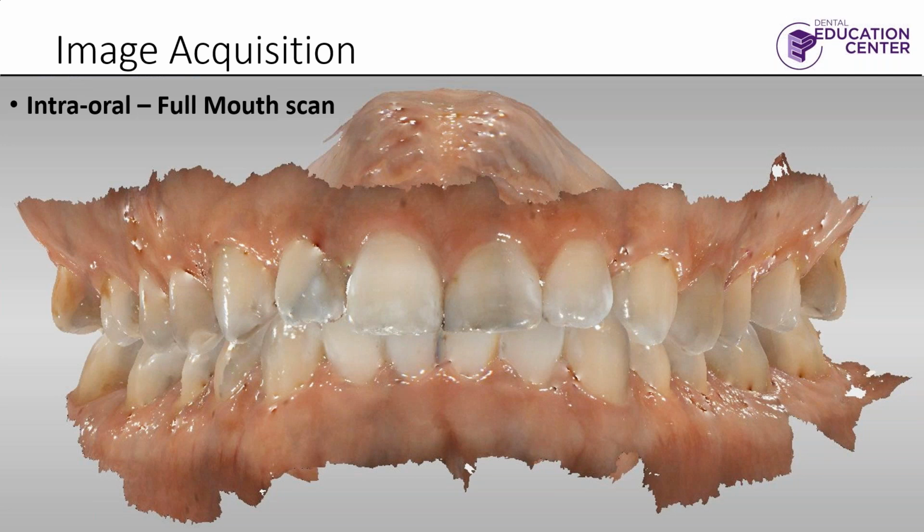selling these cases, I think it's a really valuable tool. We have like a 70-inch monitor in one of the operatories here, and when they see their mouth that large, they obviously want to start fixing things.